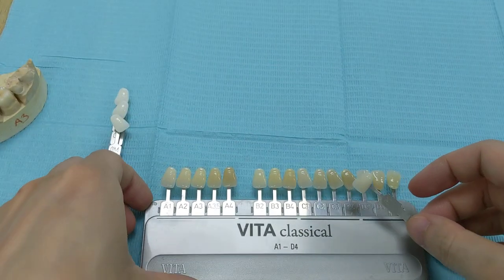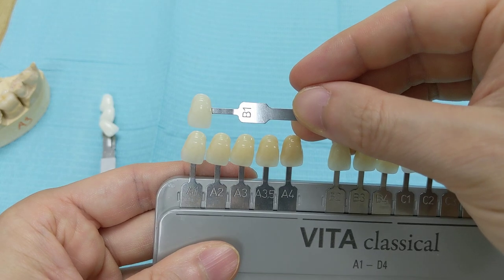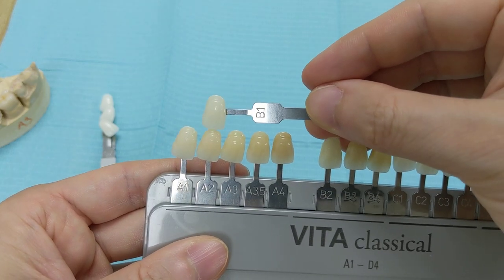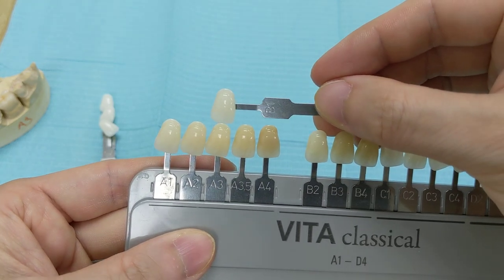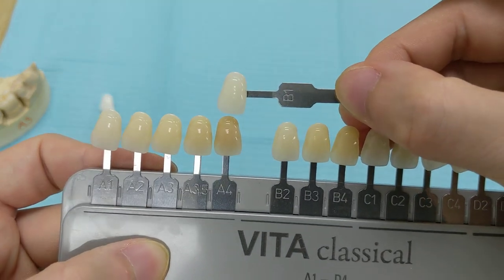I'll give you a comparison with all the tooth colors right on top so you can kind of see this. The B1 versus A1, B1 versus A2, B1 versus A3, B1 versus A3.5, B1 versus A4.